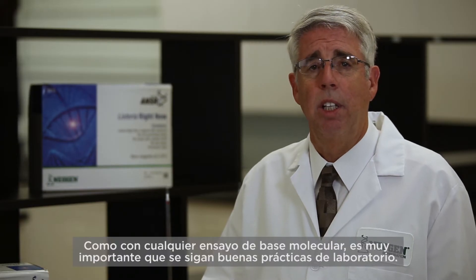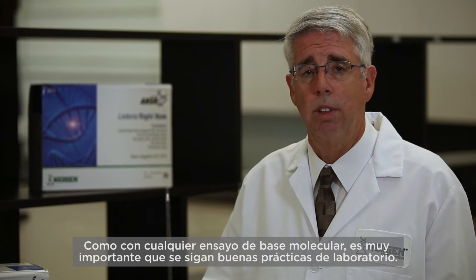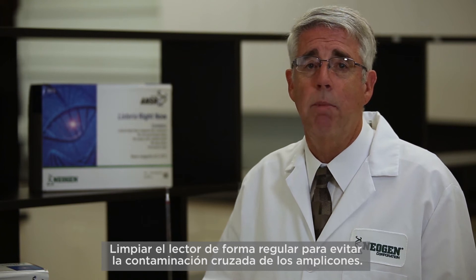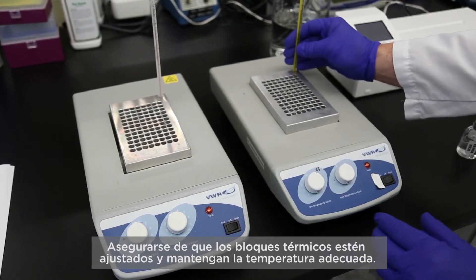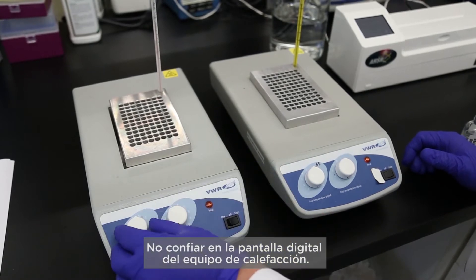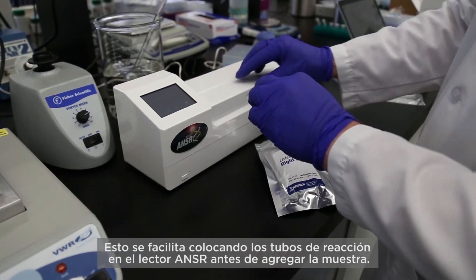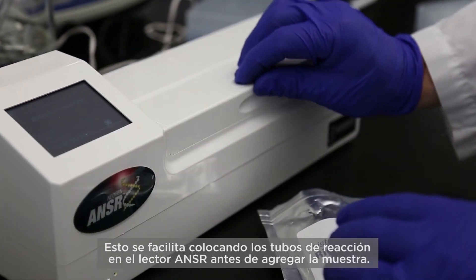As is the case with any molecular based assay, it is very important that good laboratory practices are observed. These include cleaning the reader on a regular basis to prevent cross-contamination of amplicons. Ensure that the heating blocks are set at and hold the appropriate temperature — measure the temperature with a thermometer and do not rely on a digital display of the heating equipment. Be sure to allow at least three minutes for the reaction tubes to warm to 56 degrees before use, facilitated by placing the reaction tubes into the ANSR reader prior to adding sample.